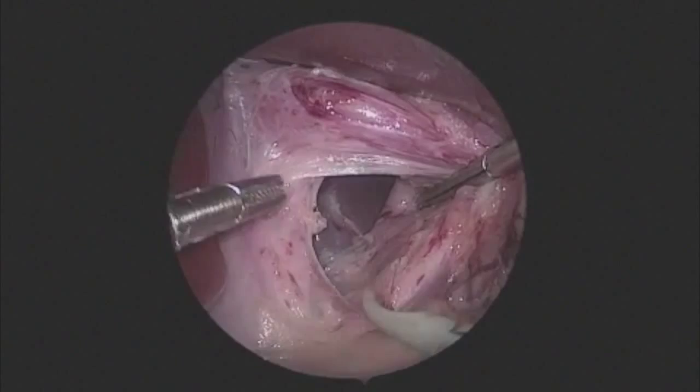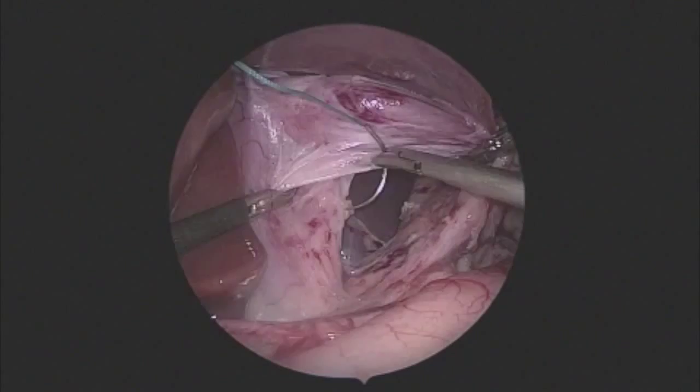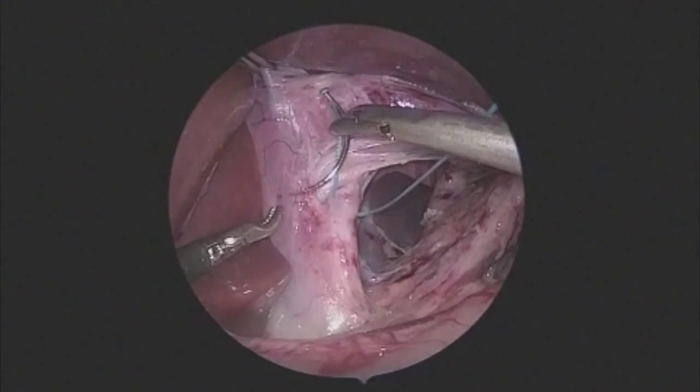Because we have limited our ports to three millimeter ports, we are putting the stitches in through the abdominal wall. This is a 2-0 Ethibond suture on an RB1 needle. We always put in a single stitch crural repair in order to try and prevent hiatal hernia in the future.